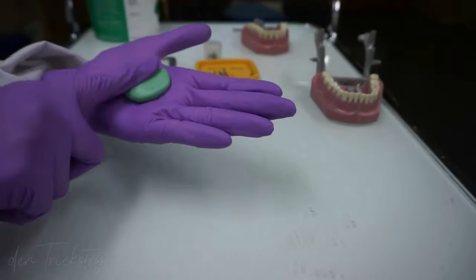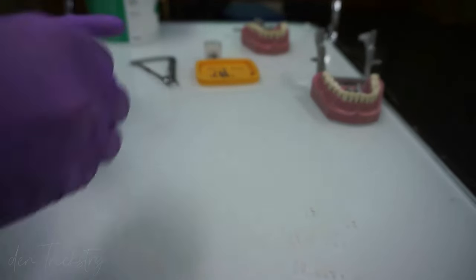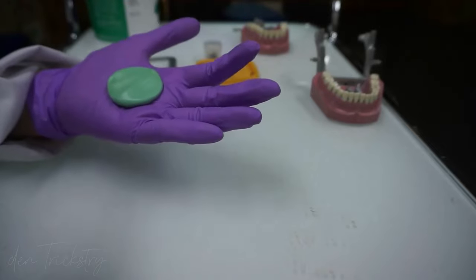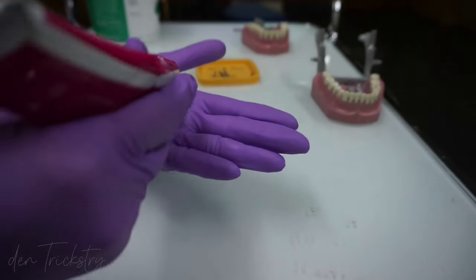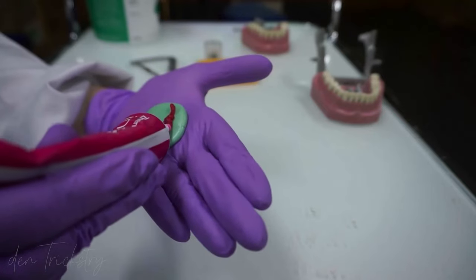The first step for temporization is making a putty index. For the putty index, I have used a condensation silicone impression material. You don't really need to use a more expensive addition silicone as this is only an index.